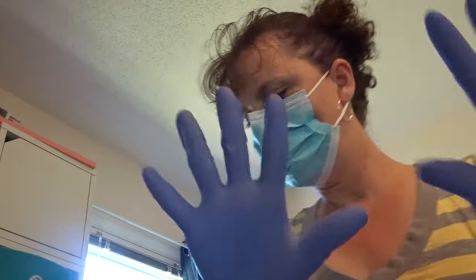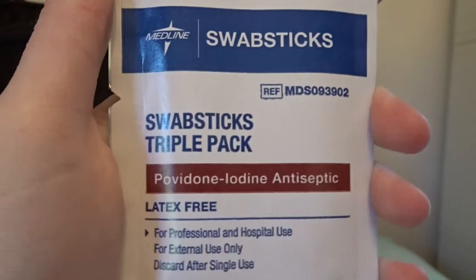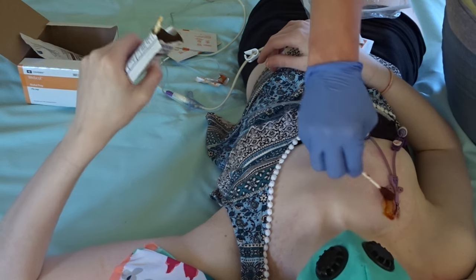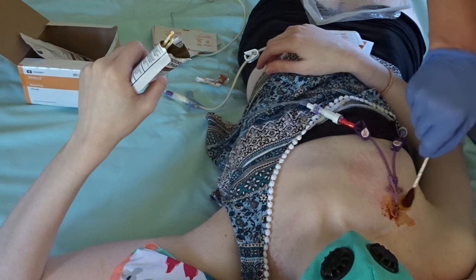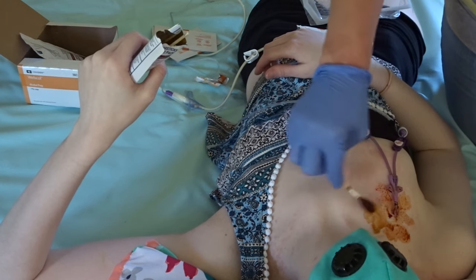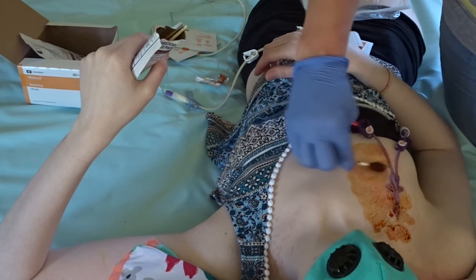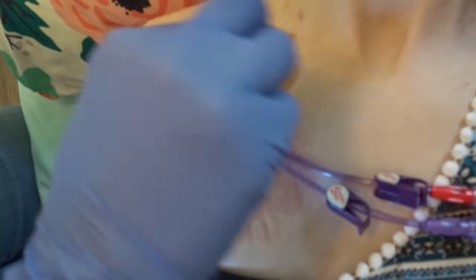Now that the sterile gloves are on, the true fun can begin. Grab your preferred antiseptic from the sterile field. As depicted, Mom and I have awesome teamwork. The additional antiseptics not included in my dressing kit are not put on the sterile field during setup because I help open the packets when needed. This ensures my mom remains sterile — she can just grab the alcohol wipe or the end of the antiseptic stick without compromising sterility by opening the packets herself.